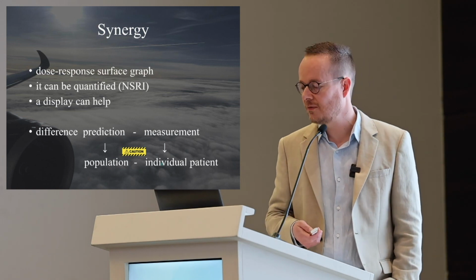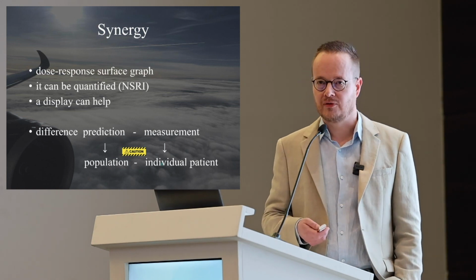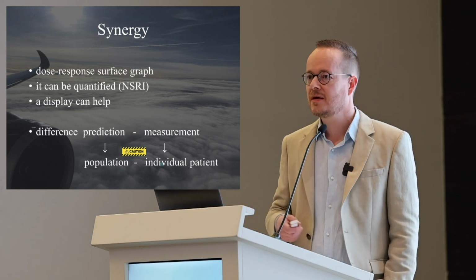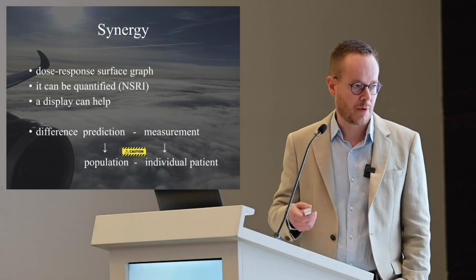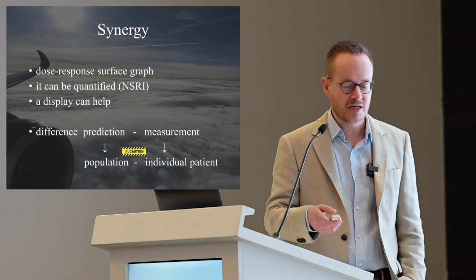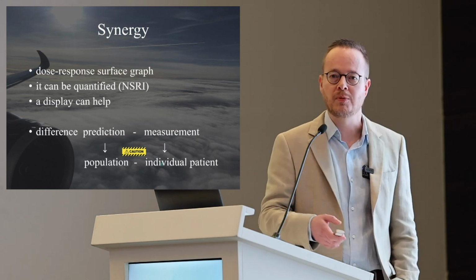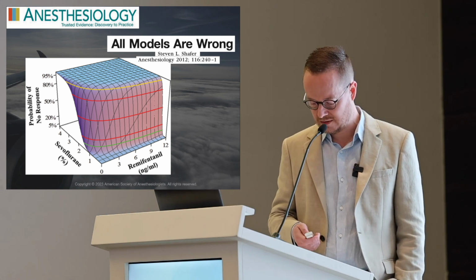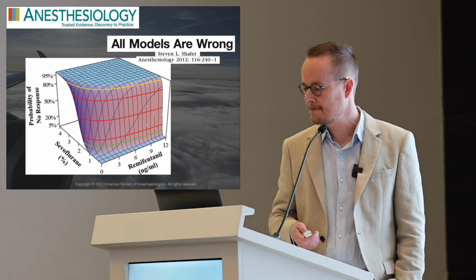If we talk about pharmacology, we have to be careful. Pharmacology is giving you a prediction, and pharmacology is talking about the population. So a prediction is not the same as a measurement, and a population is not the same as our individual patients. So keep that in mind.